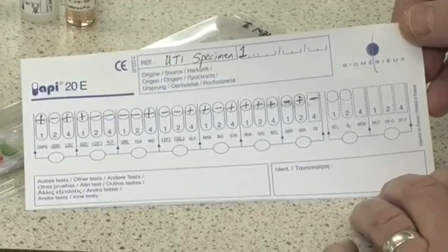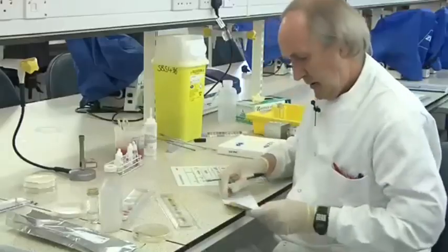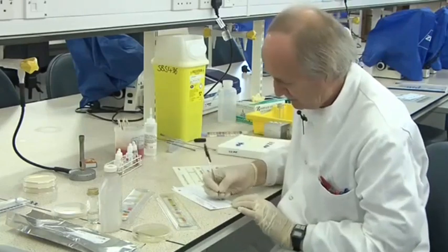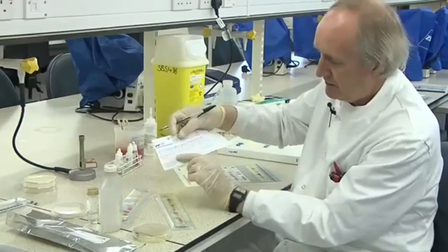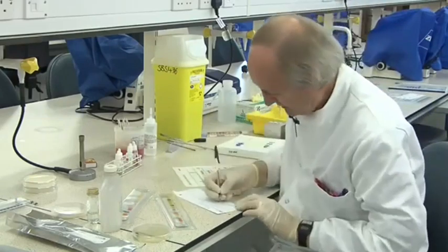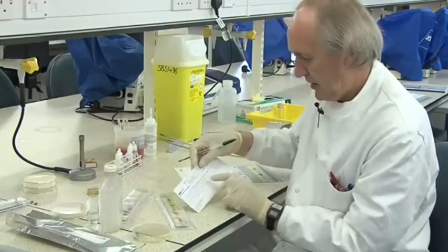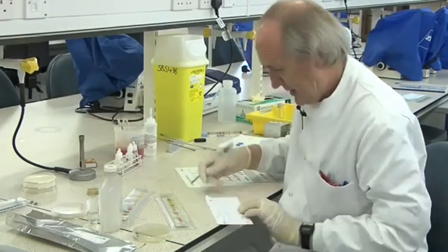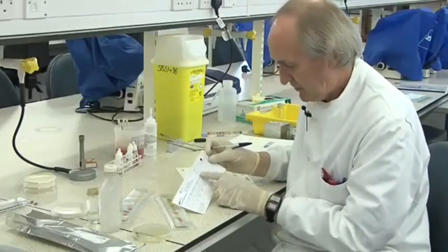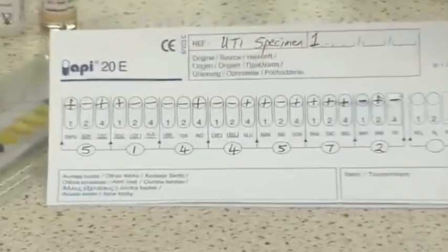Now I start adding up the score. In those first three results, the first one was positive and the third — so that's a score of 1 plus 4, making 5. The second set: the first one is positive and the next two are negative, so the first one scores 1. We're going to get a 7-digit number determined by sets of 3. The next one is only the last test that's positive, so that's 4. So I've got 5, 1, 4 so far, then another 4. And then the first and last one, so that makes 5. And then all three sugars in that set are all positive, maximum score of 7. And lastly arabinose positive — that's the middle one, so that's 2. So we've got a 7-digit number: 5, 1, 4, 4, 5, 7, 2.